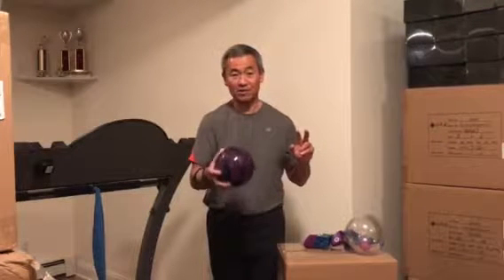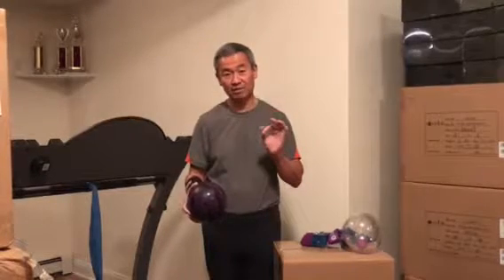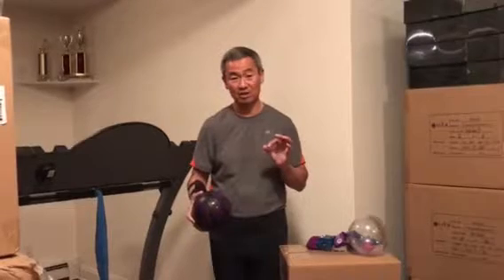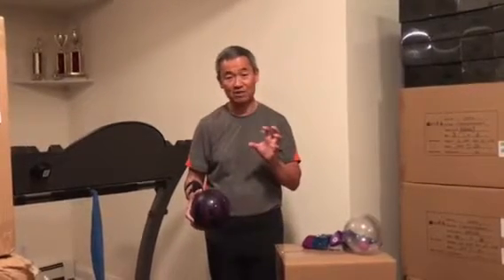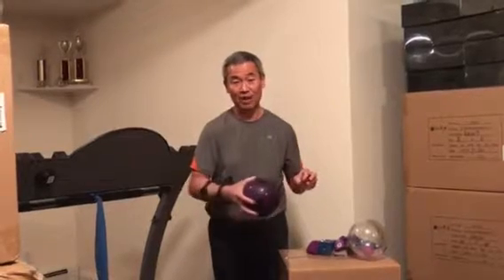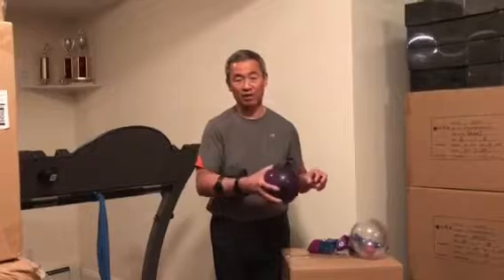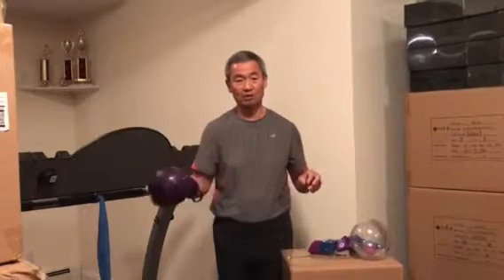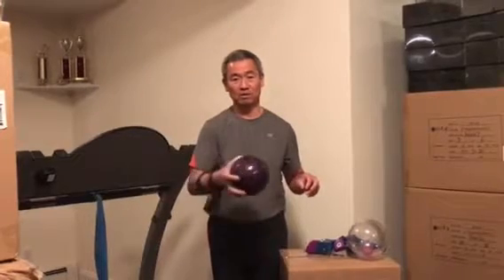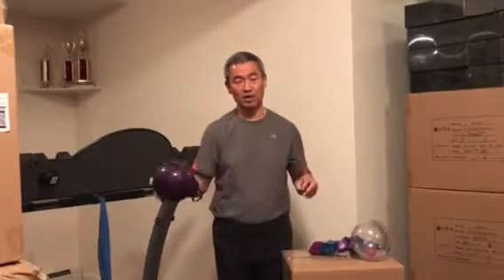If the ball bounces, that means the rotator cuff got shut down. The only way to ensure that the rotator cuff is functioning, with all the muscles working simultaneously, that is the value of the ShoulderSphere, is that it is rotating all the time while going out and going in. So this will be 1, 2, 3, and so forth. Do 10 times of that.